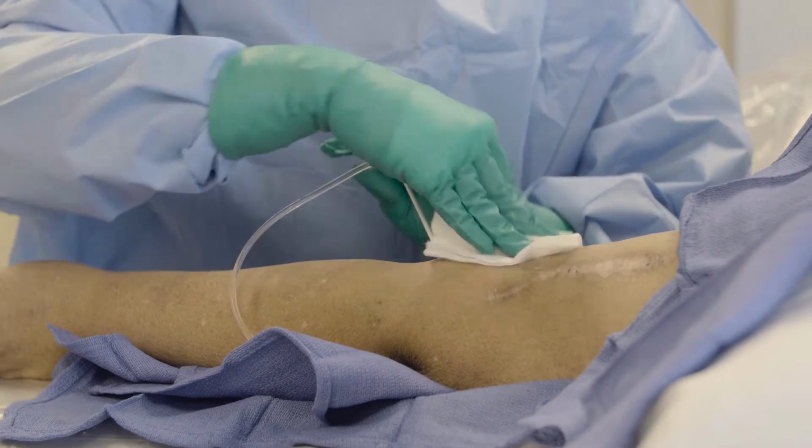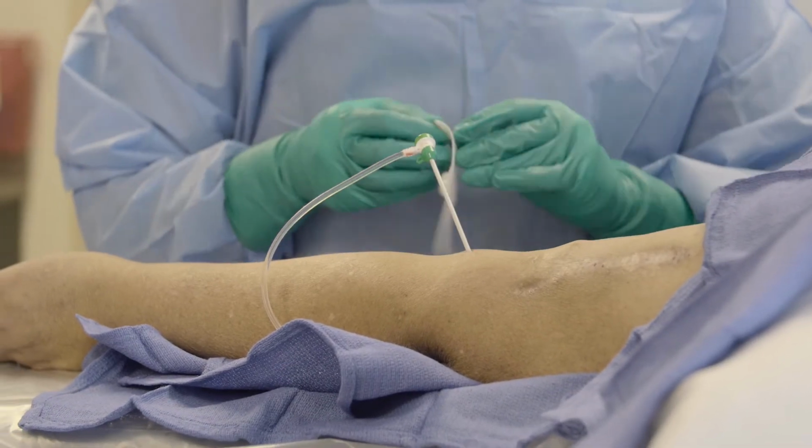A graft is a synthetic tube. It can be straight or in a loop configuration. It can be in your upper or lower arm. It can last years, but not typically as long as a fistula, usually about 2 to 3. It's slightly more prone to infection than a fistula, but not much. It heals in only about 2 weeks after it's placed. It's good for those with poor sized veins.